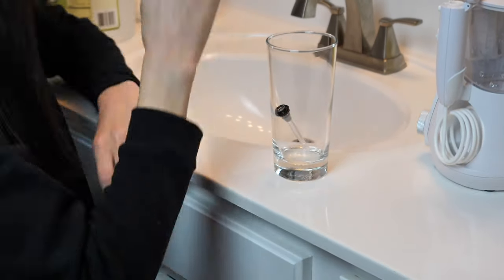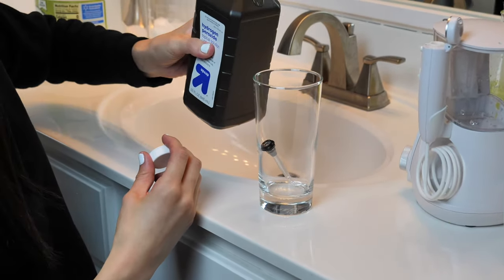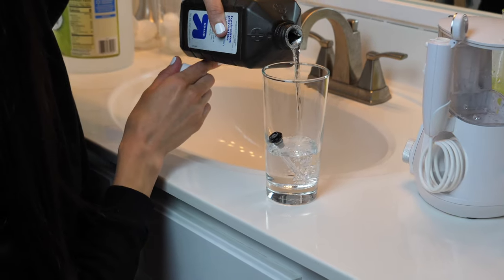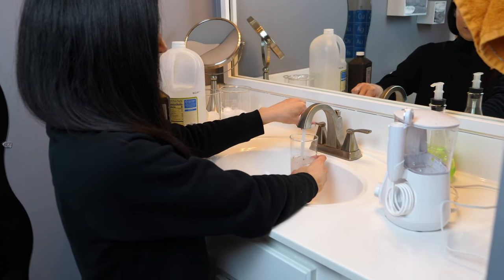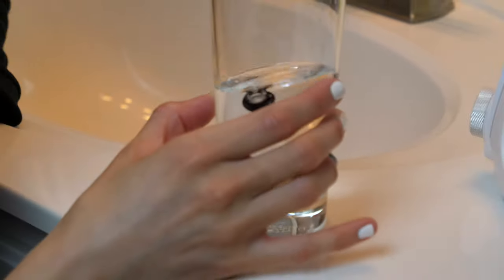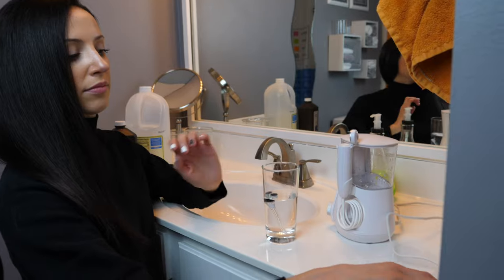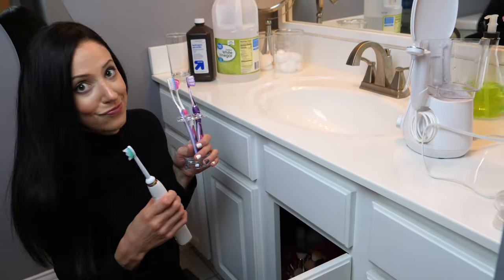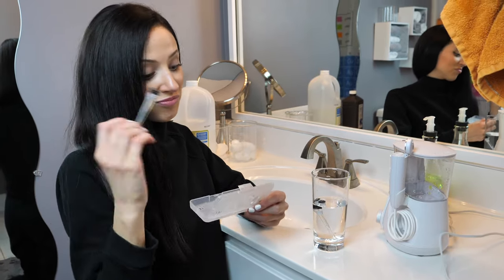Next, I clean the tip itself. You can remove the tip, and the directions say you can use either hydrogen peroxide or a vinegar mixture. Since I've been using vinegar this whole time, I like to use H2O2 for this last step. I fill up a cup with about two parts water and one part hydrogen peroxide — you can use vinegar instead — and let the tip soak for about five minutes after rinsing it under warm water. Technically, directions say to replace the tip every three to six months, but I usually get a new tip every six-ish months.